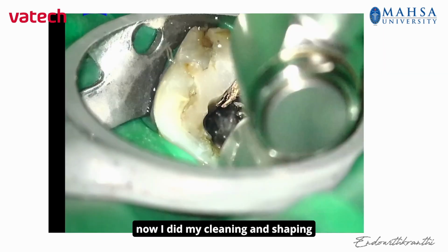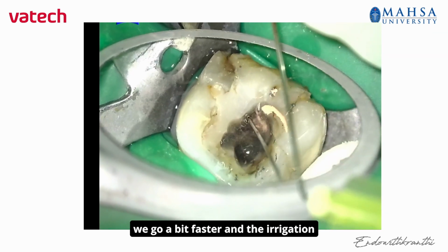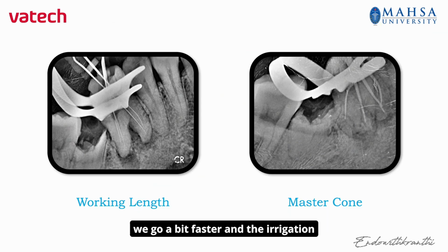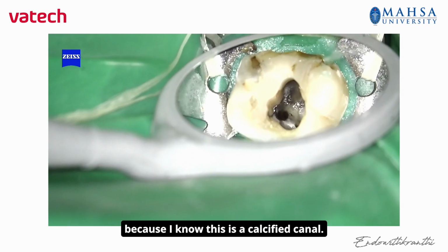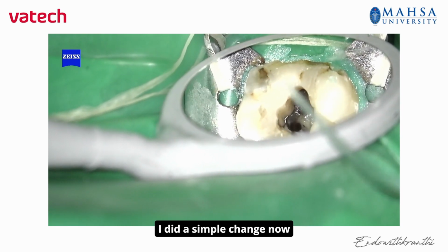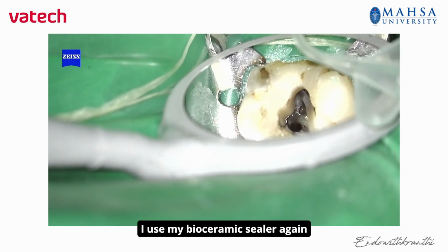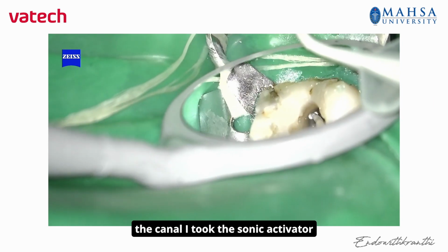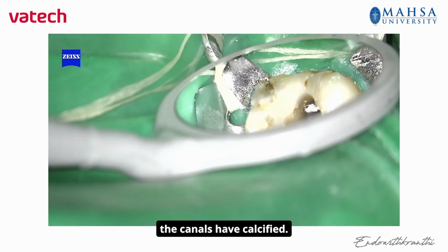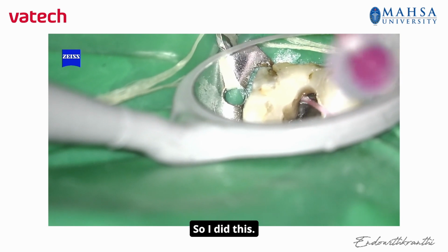So now I did my cleaning and shaping. This one will go a bit faster. I'm doing irrigation. You can see there, I can go my length. So what I did, a bit of change here. Because I know this is a calcified canal, I did a simple change. Now how you execute treatment also matters, right? I used my bioceramic sealer, again Ceraseal, inside the canal. I took a sonic activator because I already know that the canals are calcified. The chance of extrusion is almost negligible, right? So I did this.